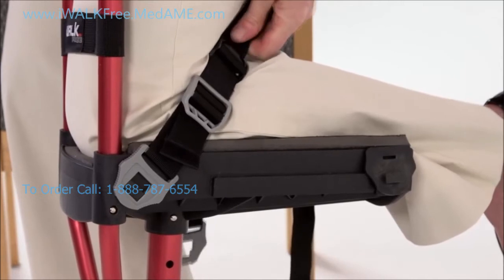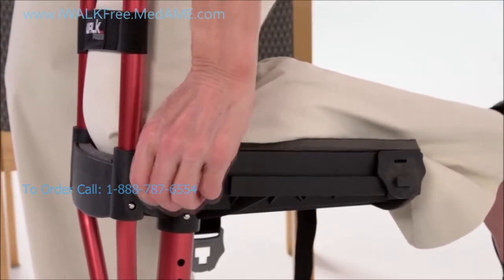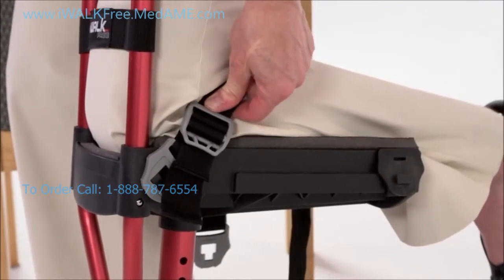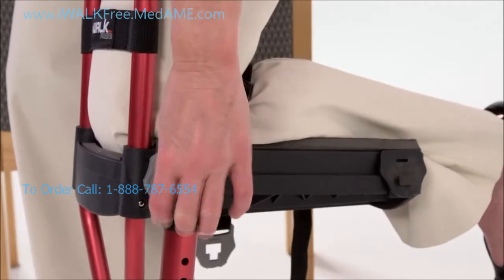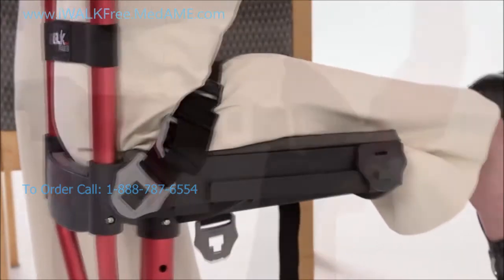If you've got it right, you shouldn't ever have to adjust this part again. Now pull on the donning and doffing strap to lock yourself in. It should be really tight, especially when you're learning. Getting a finger between the strap and your leg should be possible but not easy.